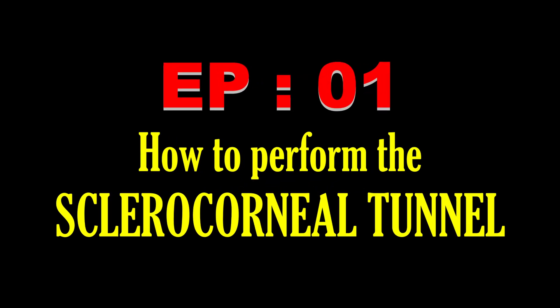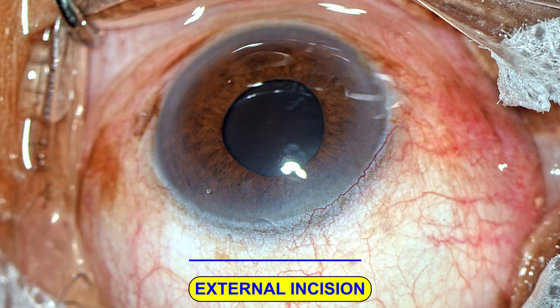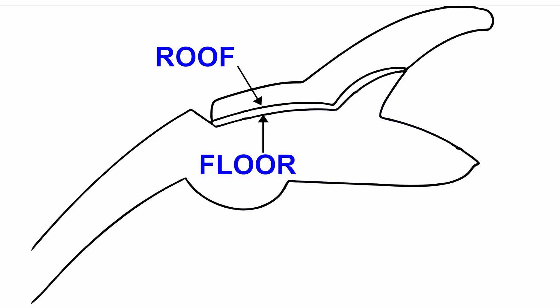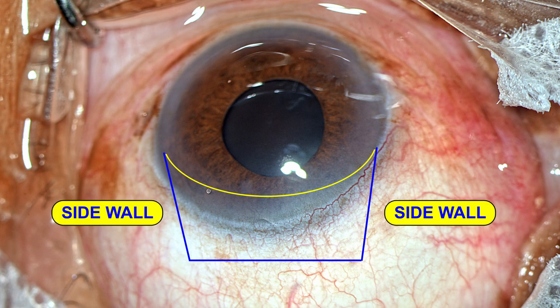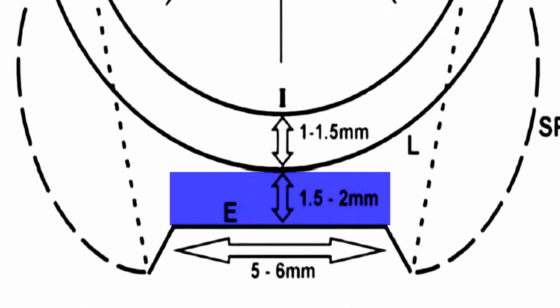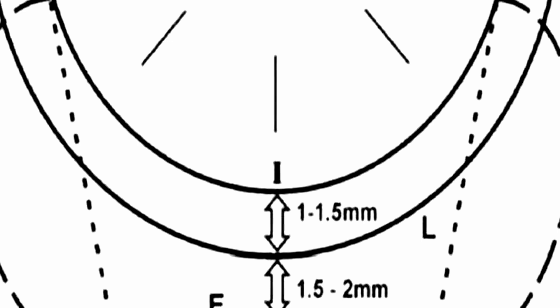In the first episode, I will be showing how to perform the sclerocorneal tunnel. Let's understand the morphology of the sclerocorneal tunnel. It has got an external incision, an internal incision, a roof, a floor, and two side walls on either side. The external incision is in the sclera about 1.5 mm from the limbus, and the internal incision is in the cornea, again 1.5 mm from the limbus.